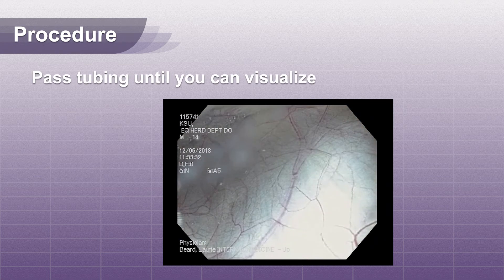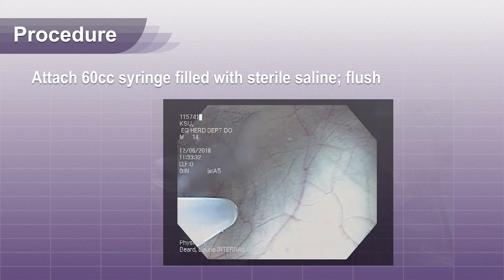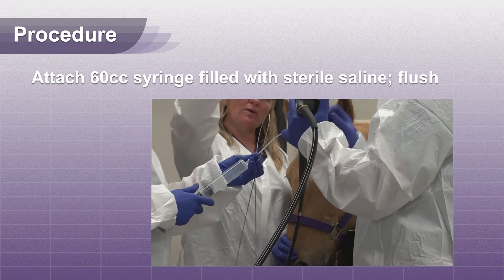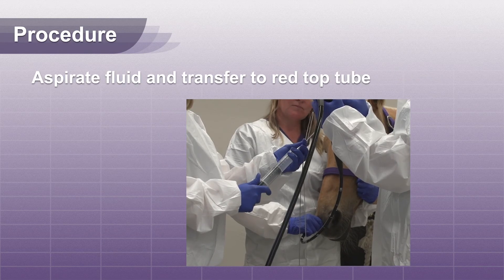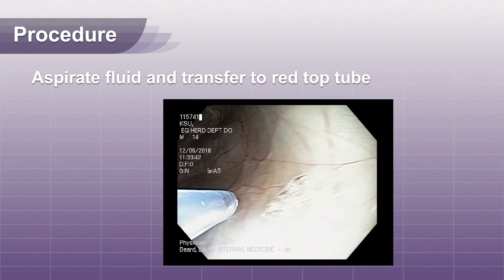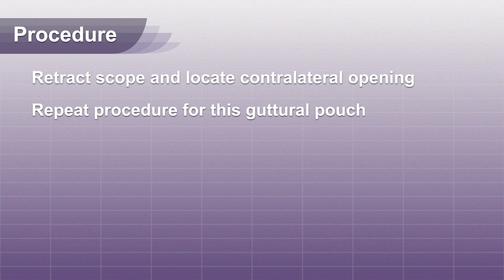Pass the polyethylene tubing until you can visualize. Attach a 60 cc syringe filled with sterile saline and flush slowly. Use negative pressure with the syringe to aspirate fluid and transfer to a sterile red top tube. Retract the scope from the guttural pouch and locate the contralateral opening. Repeat the procedure for this guttural pouch.